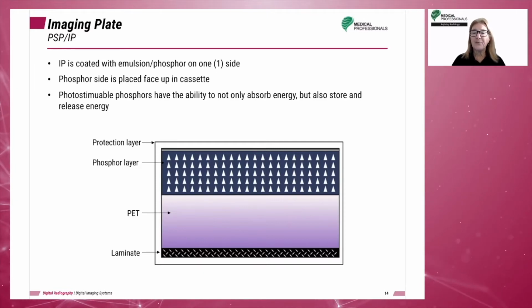The phosphors must have the ability to absorb energy, store energy, and release the energy upon proper stimulation or excitation. Certain barium fluorohalide compounds exhibit these characteristics.